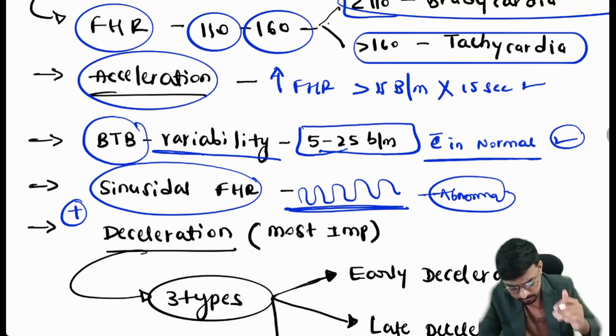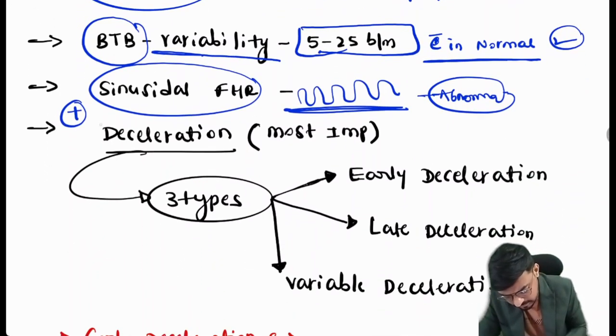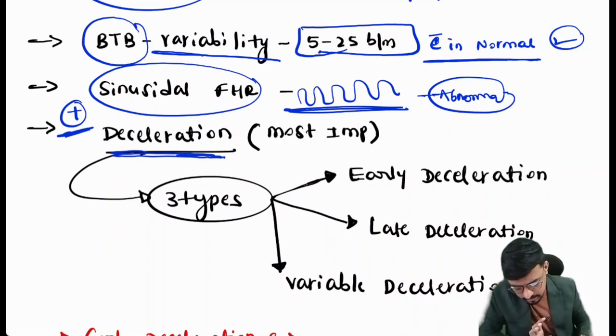So one more important thing: all these things we have studied in the NST are also components of the CTG, but in the NST there is no deceleration, while in the CTG we will study one extra component, that is the deceleration. This is the reason that before teaching the CTG, I have given a complete brief idea related to the NST. If you don't know the NST, you don't know the CTG. That is the simple thing.